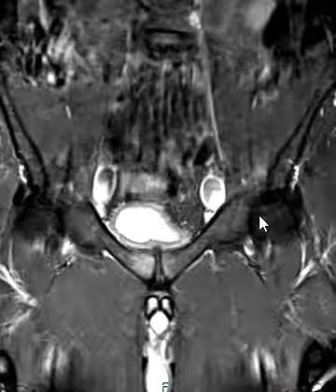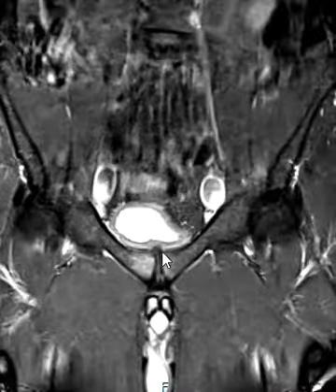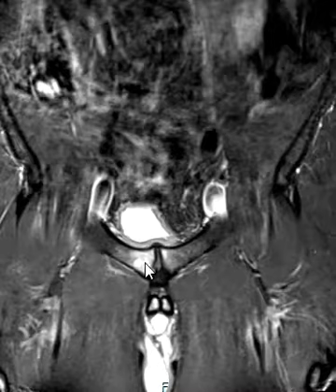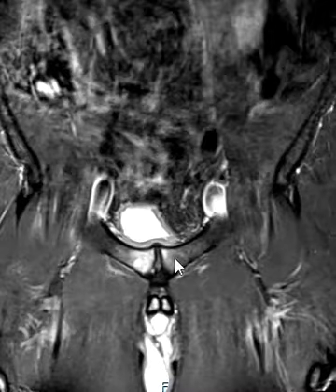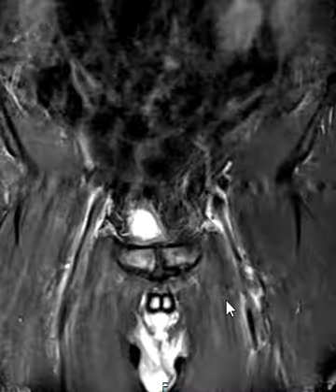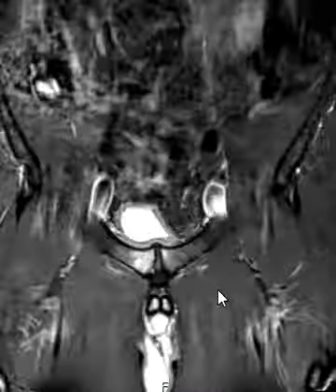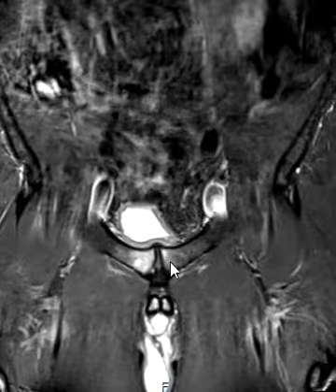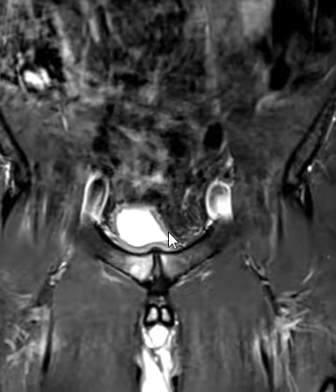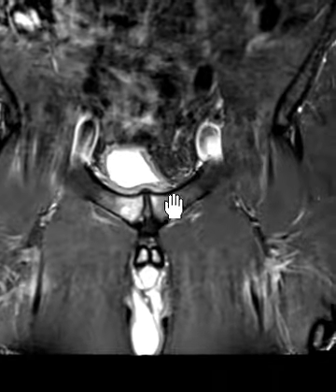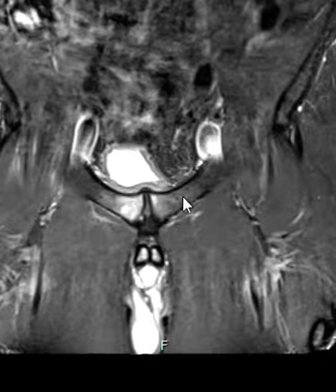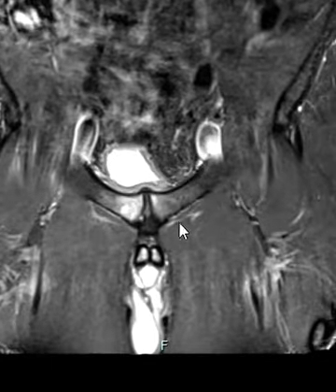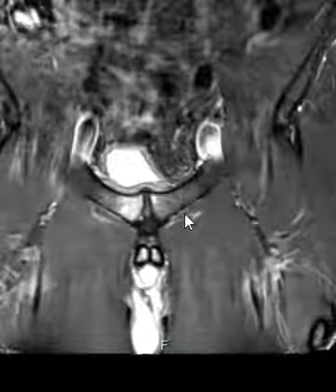On this view here we can see the pubic symphysis right here in the middle, the right pubic bone and left pubic bone. You can see on these STIR images that there's very bright signal on both sides of the pubic bone, worse on the right hand side. This is what they call osteitis pubis from shearing forces and increased stress on both sides of the symphysis pubis.